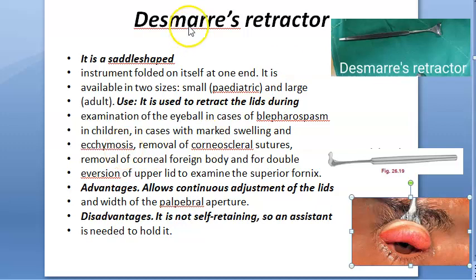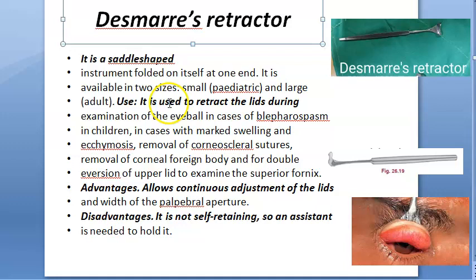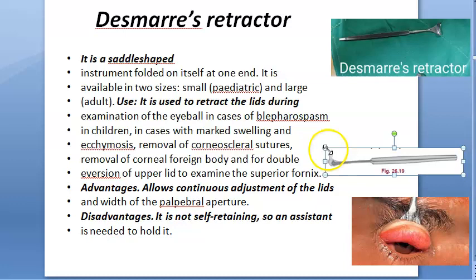In this video, let us look at Desmar's retractor. What are you retracting here? The eyelid. So basically, this is a saddle-shaped instrument. It is a saddle-shaped instrument.